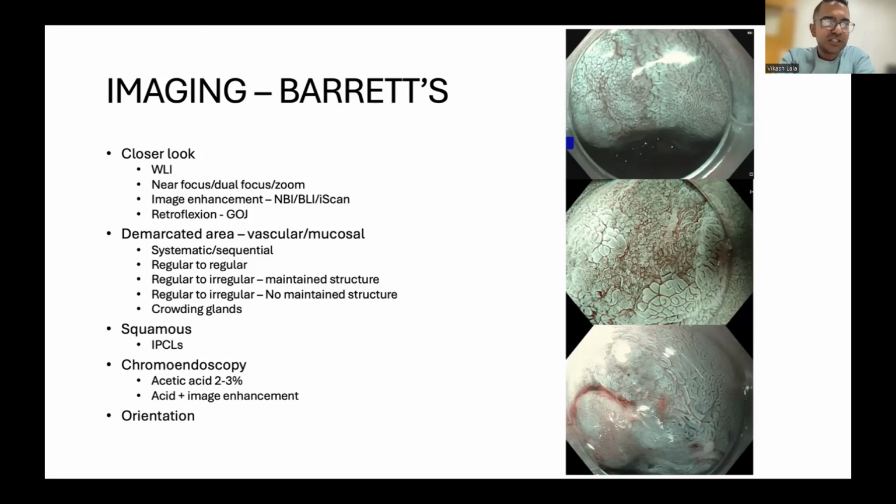Most of the images I show you today are all taken with a standard Exera 3 HQ190 scope, or H190 scope, which is probably one of the most common scopes that we all have. So you don't need high-end imaging, but what you really need is to know how to use what you have. For example, on the HQ190 scope, there is a feature called near focus. This feature is not programmed onto your scope and it's not on your stack. You need to actually program it on one of the buttons yourself, but it's an invaluable tool.